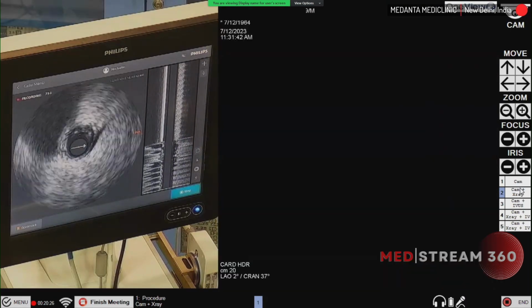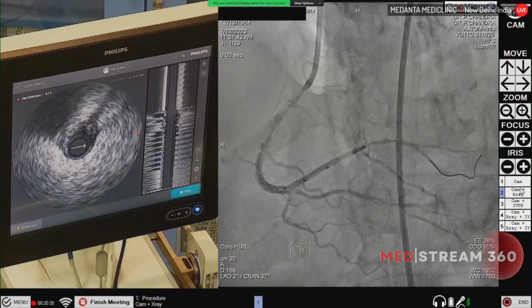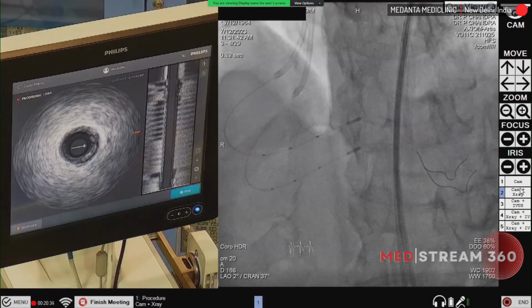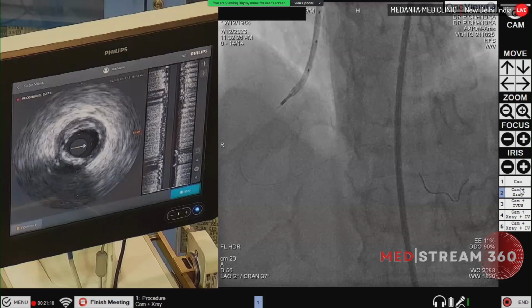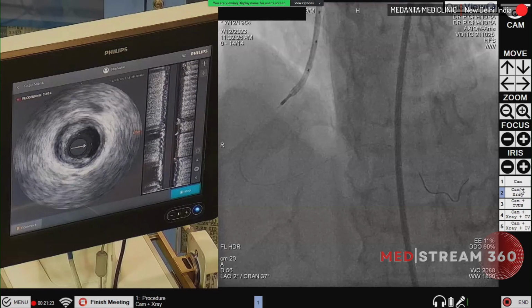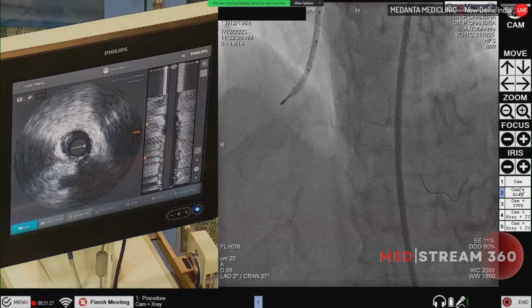So we'll pull back, and yes, there is calcium here. Can you do just a quick check? Yeah, where we are. Yeah. So this is very clear that this is a significant lesion out there, and disease there. And this is the tightest part, you see. And there is some ulcerative lesion here, mixed heterogeneous plaques out there. But interestingly, the distal lesion is quite significant.